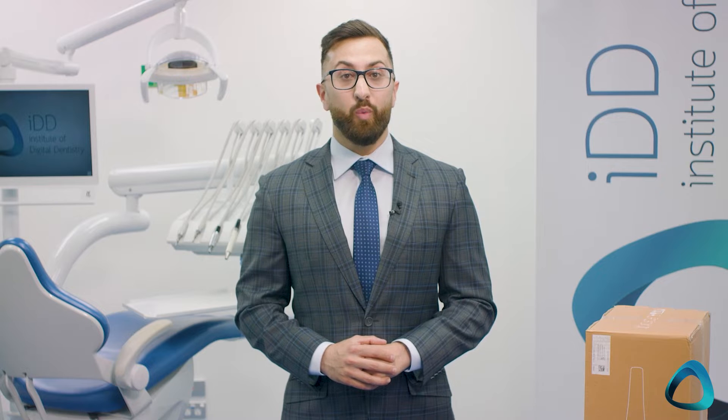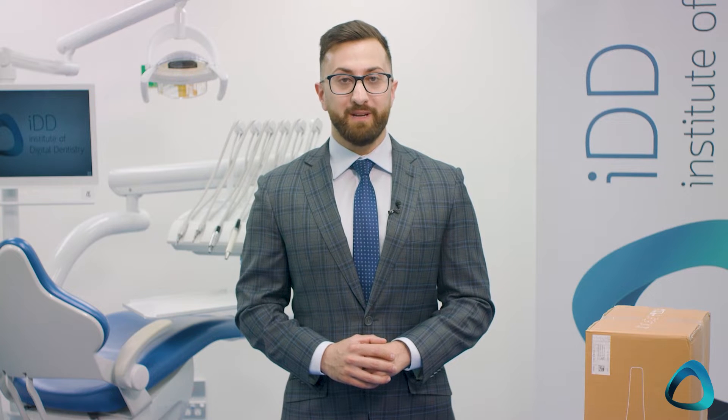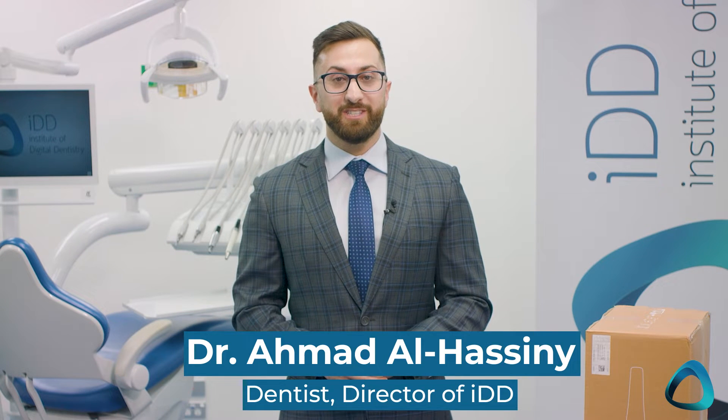Hey everyone, I've got some exciting news. The team at Medit has kindly sent me the first Medit i700 wireless scanner in Australasia and one of the first units in the world to beta test over the past few months. Yes, you heard that right — a wireless Medit scanner. I'm Dr. Ahmed Al-Hasni from the Institute of Digital Dentistry and I'm super excited to share this scanner unboxing video with you.